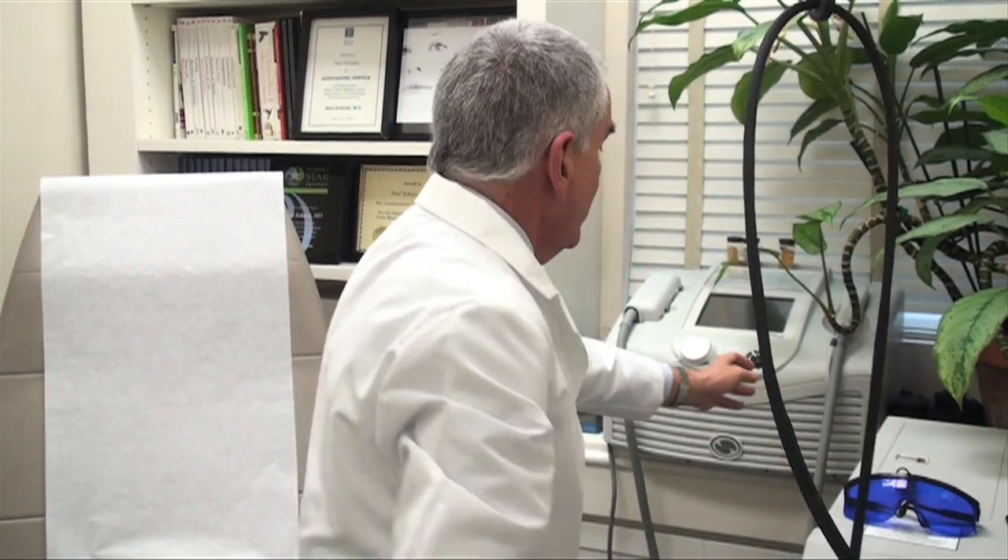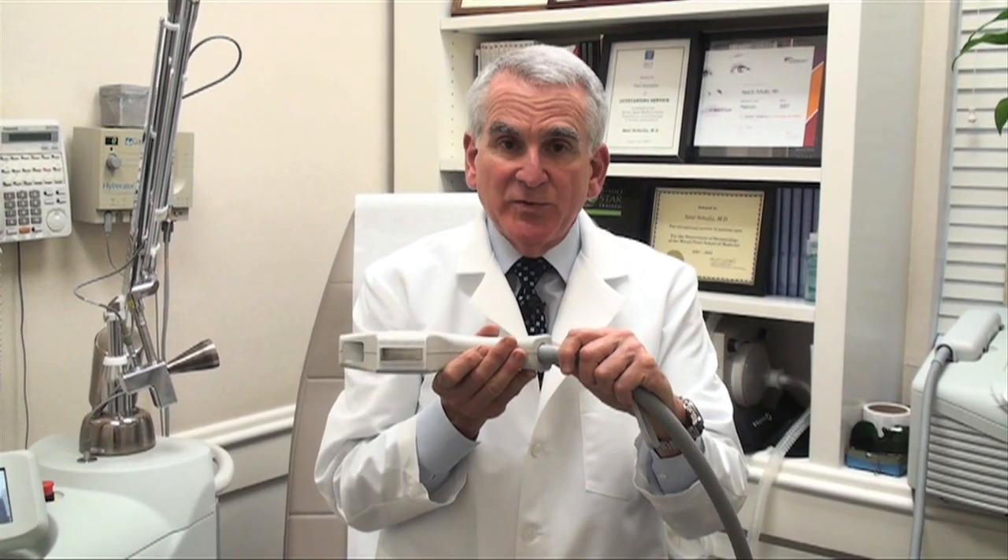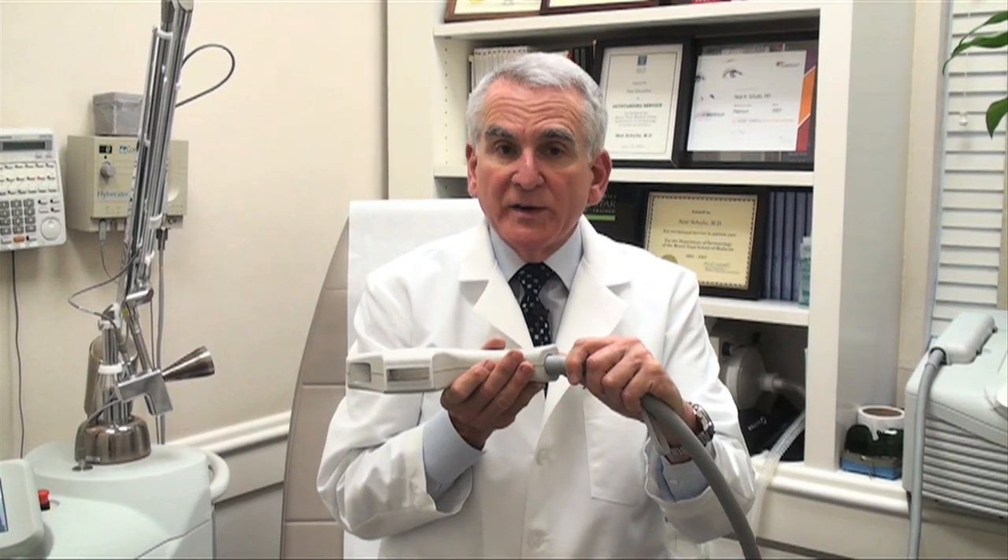Lastly, let me show you a laser that we use for brown spots. It can also be used for tattoos. This laser handpiece is large and rectangular. It can do large areas of brown pigmentation, liver spots, age spots — on the face, on the legs, on the arms. Again, just a real nifty device for getting rid of those unwanted brown spots.